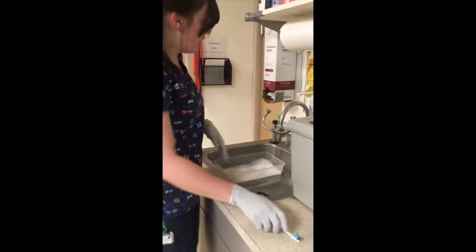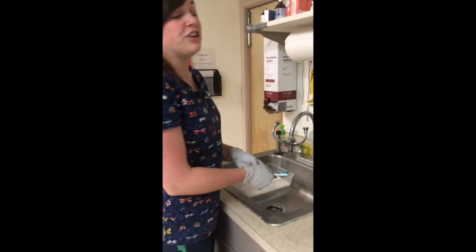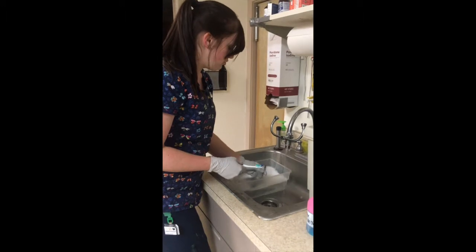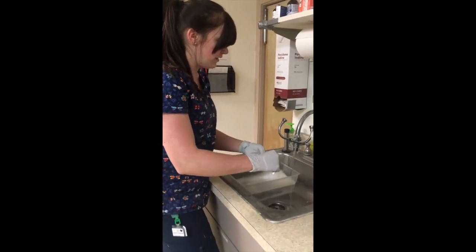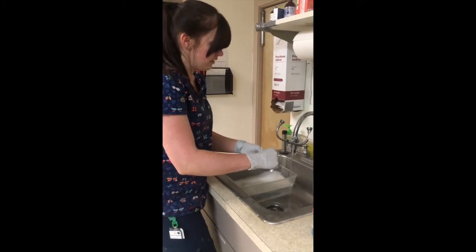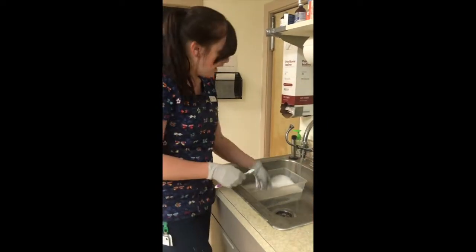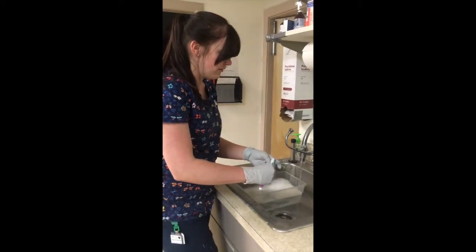And I'm going to take a scrub brush and some Chlorhex scrub, and I'm going to scrub each instrument. So I'm going to turn on some water, take the instruments, and I want to make sure that I scrub every side of the instrument, including underneath the identification bands. If the instruments have any kind of ravine or etching, you want to make sure that you scrub in both directions to make sure that you get all debris out of the instrument.